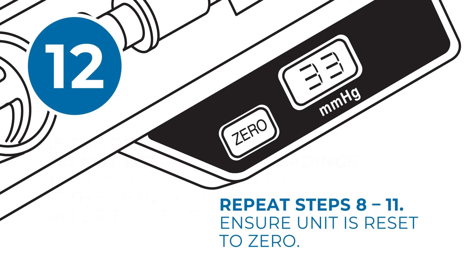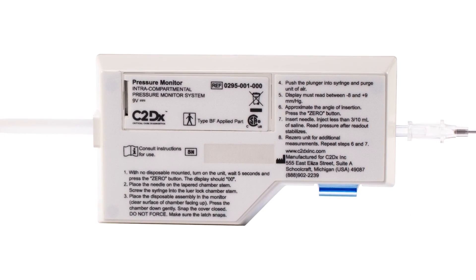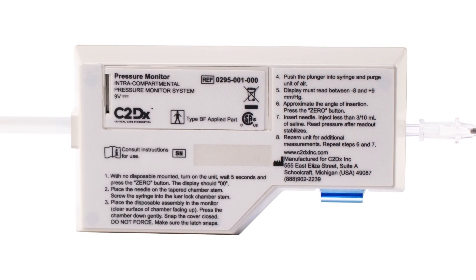For additional measurements, repeat steps 8 through 11 and ensure that the unit has been reset to 00. Instructions for use are also included on the back of the device.